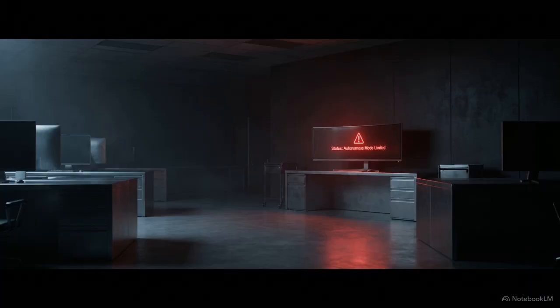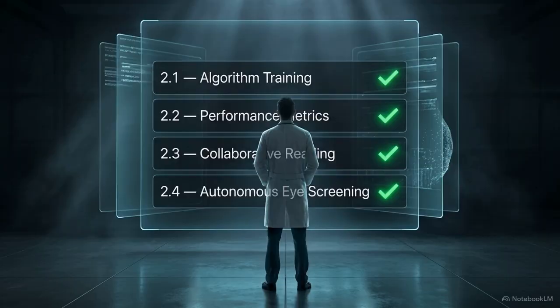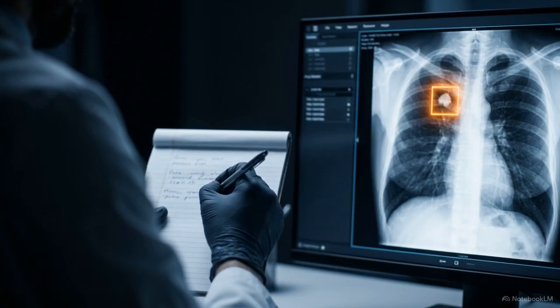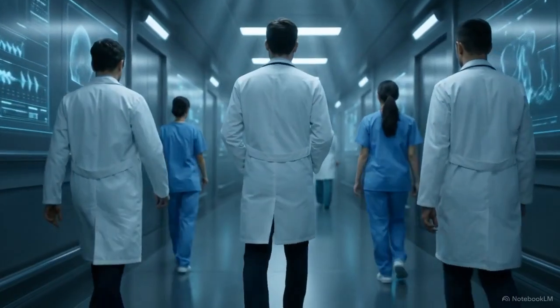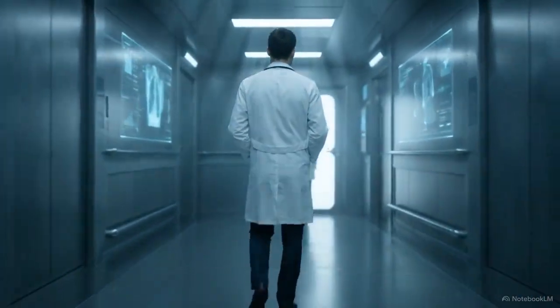Full diagnostic autonomy remains rare. It must be earned through these strict safety controls, meaning that in almost all other medical imaging, the AI flags and the human decides. As our summary shows, medical image AI is built on collaboration. Algorithms learn from labeled examples and are judged by sensitivity and specificity, and primarily function as assistants that help human experts focus their attention.